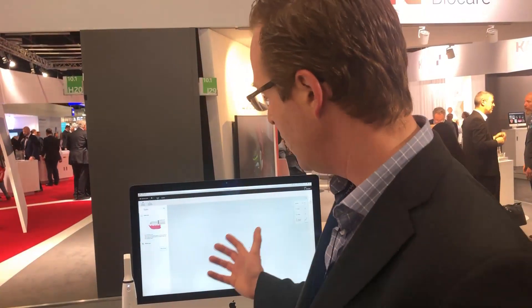Hi everybody, this is Dr. Scheer here at IDS Cologne looking at the CAVO X-Pro intraoral scanner coming from Nobel, CAVO, Danaher Corporation.